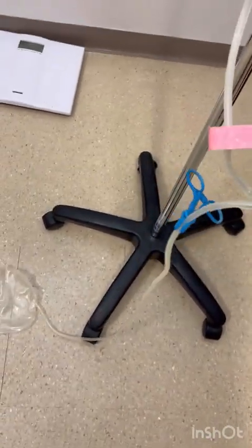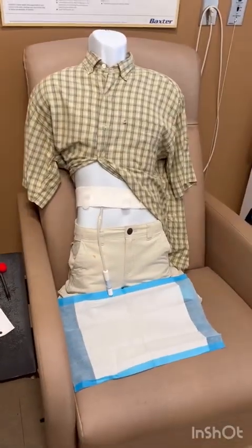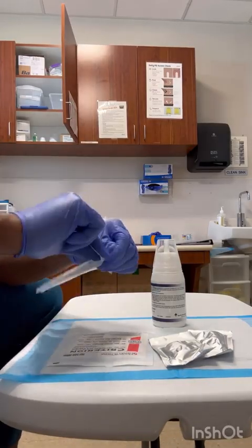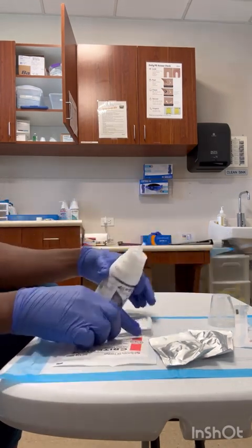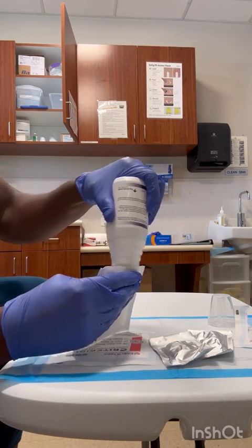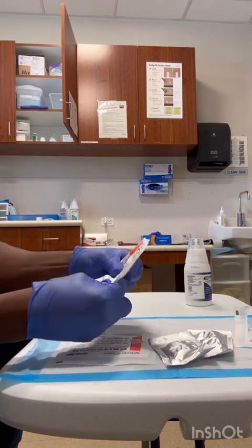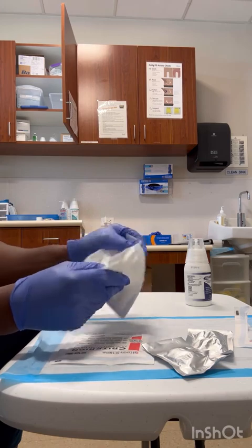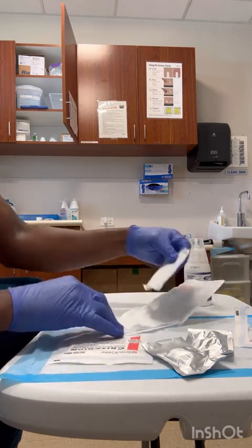Now I'll just have to clean Steve's transfer set. First thing I'm going to do is open my 4x4, put a good amount of Alcovis disinfectant onto that gauze — no specific amount, just get it pretty saturated. You can also just open it up and pour it on the gauze. Make sure it gets fully soaked. Open it up, separate it — remember there are two pieces of gauze in there.